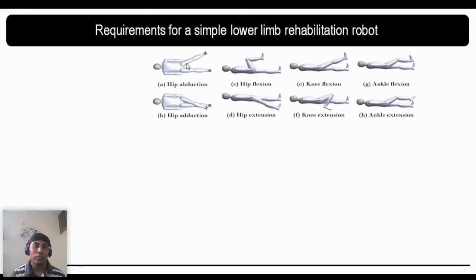So indirectly you would be keeping your shank, or crus, which we call the calf muscle, and then you will be bending left and right. So this is really advanced therapy which is not required at the initial stage. That's why I did not put that figure. Similarly, the ankle would also have abduction and adduction, and the ankle would have a little more therapeutic treatment. These are not really laborious or complex, so that's why I did not put it here.